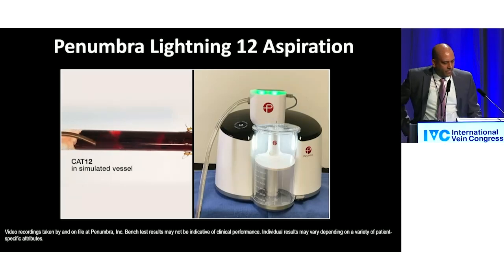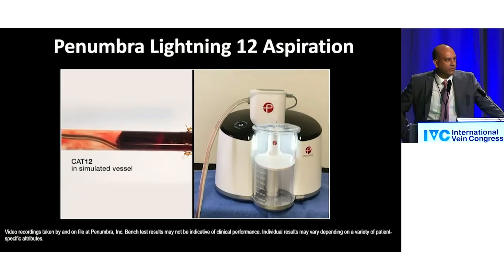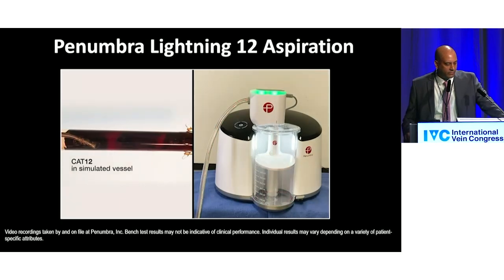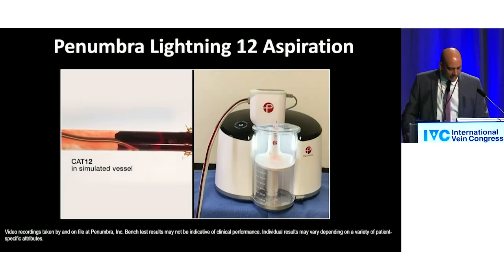If you look here, you can see that the green light goes off and on. And basically what it's doing is that when it's in flowing blood, it turns off because we don't want to just exsanguinate the patient, right? So it turns off. And when it's in non-flowing blood or the catheter is clogged, then the machine turns on to its really maximum capacity.